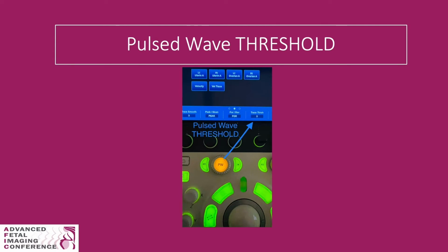Once again, notice the very close proximity of the threshold button with respect to the pulsed wave button. Your ultrasound units are built with user-friendliness in mind. Familiarizing yourself with your ultrasound units is something that will pay off tenfold for you, thereby simplifying your workload and allowing you more downtime.